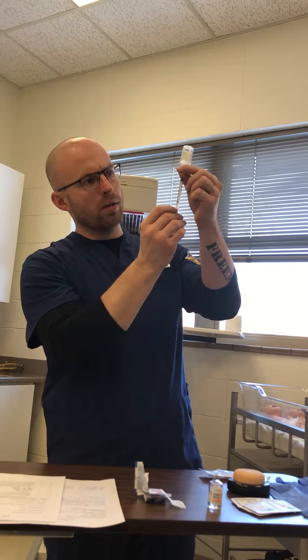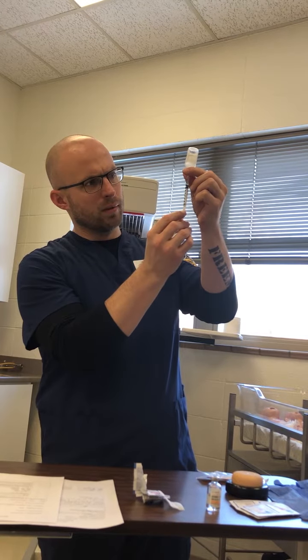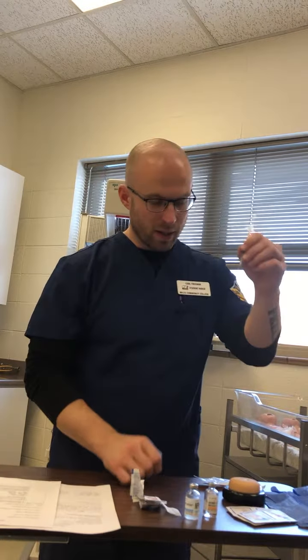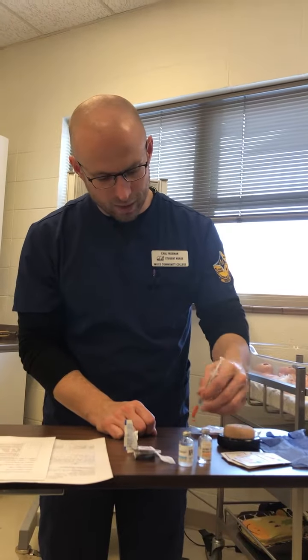We are going to insert our syringe into the NPH, turn it upside down at a 90-degree angle, and we are going to bring out 20 more units for a total of 30. We are then going to recap our needle without touching it.